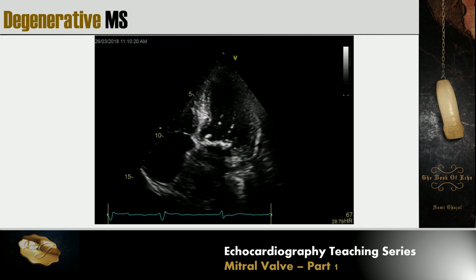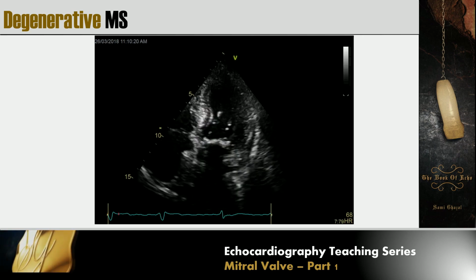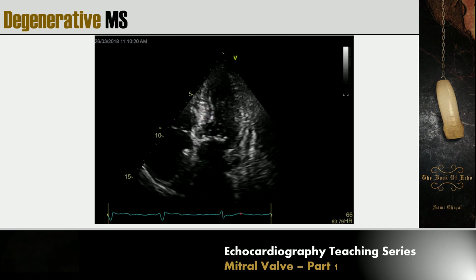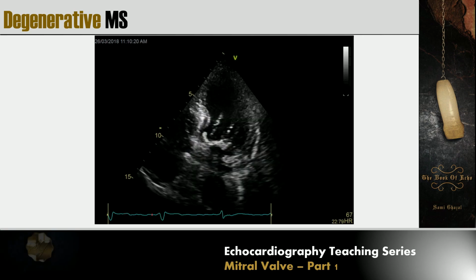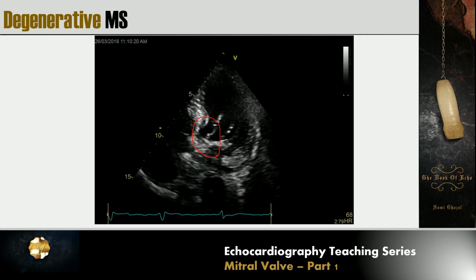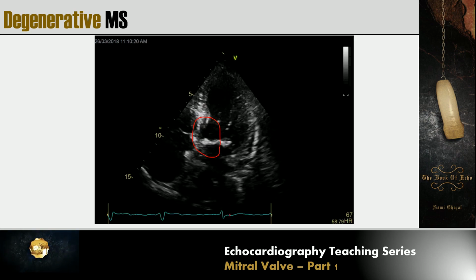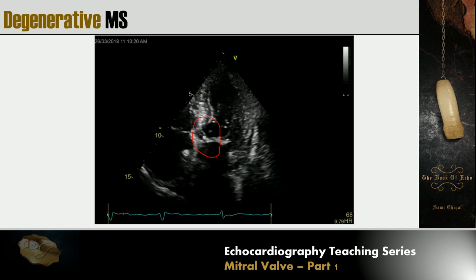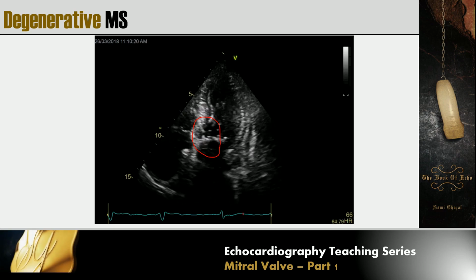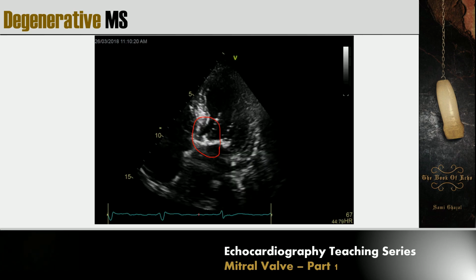So this is a video of severe mitral annular calcification, and sometimes we can note a mobile element. If you look carefully here, you will note a mobile component that will cause increased risk of embolization and maybe stroke, etc.